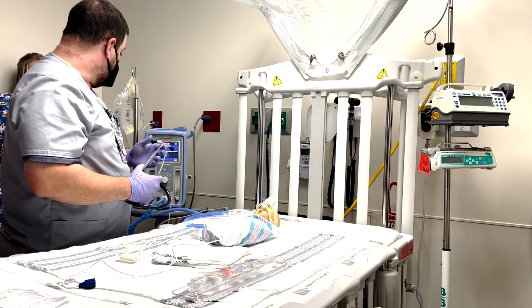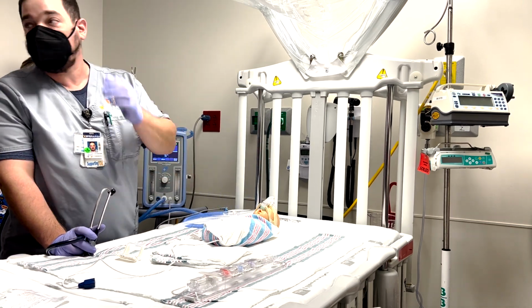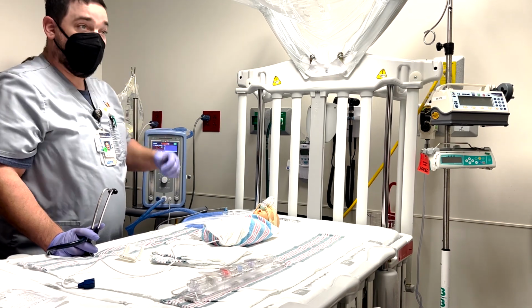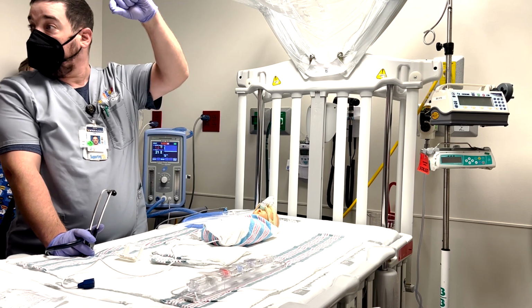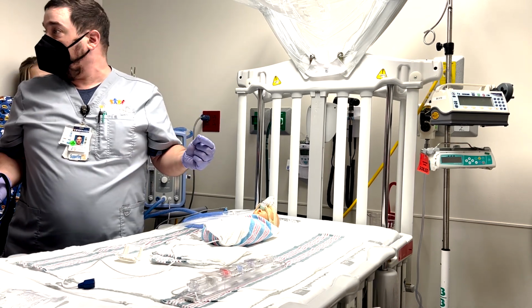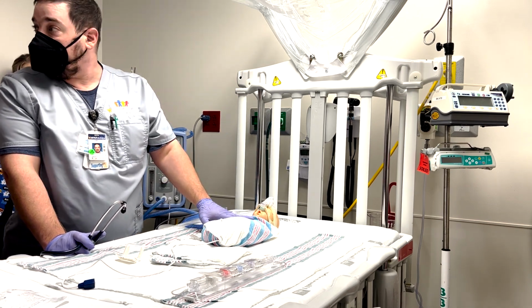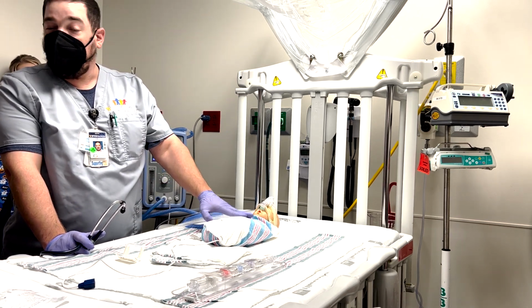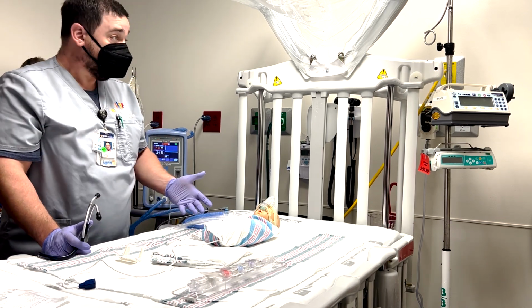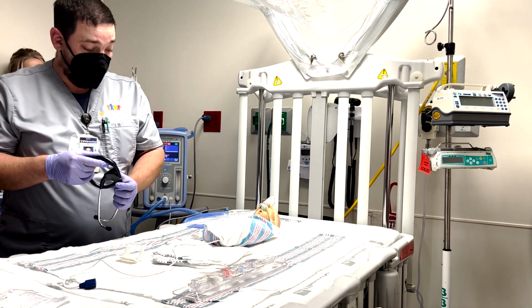CPAP does not go by the look. This could be smushed up against the patient's cheek and still giving me a CPAP number. You saw as I was holding it, it's just saying, yeah, okay, that's 5. I'm happy with that, my tubing, I'll work with that. But I want to hear a good flow sound in the baby's chest, and that flow sound should improve as they recruit. So always listen to your patient.